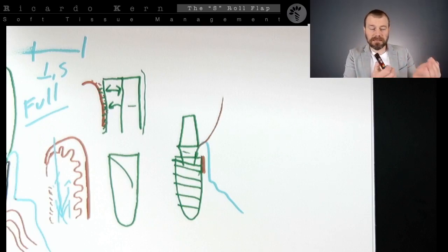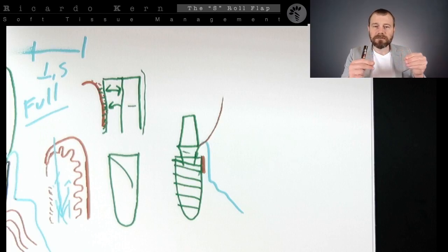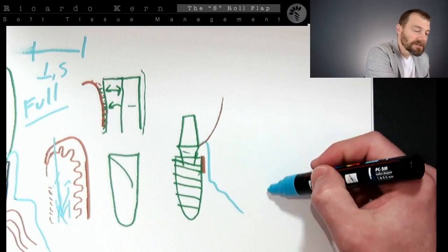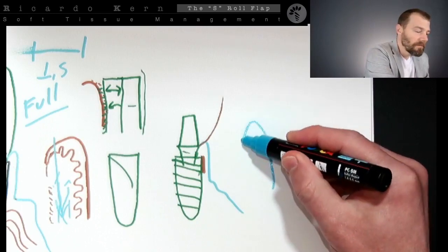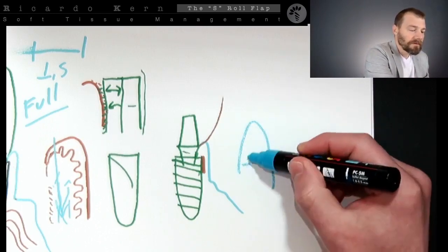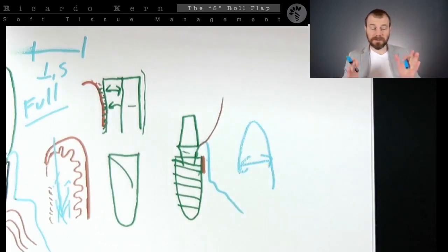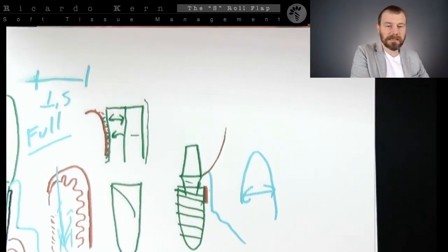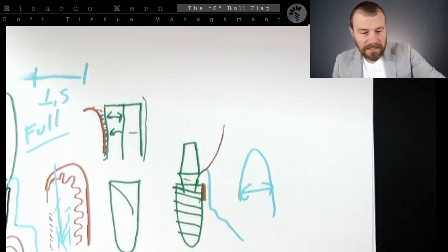So you're going to leave on the surface of the implant some of the periosteum, some of the connective tissue, still nourishing, still protecting this area. And you're going to try to leave as much as possible of the volume of the tissue on the flap, this area here, because it's thin, and you're going to try to protect that, okay? So usually on implant surfaces we have exactly this kind of approach. Let me just move here.